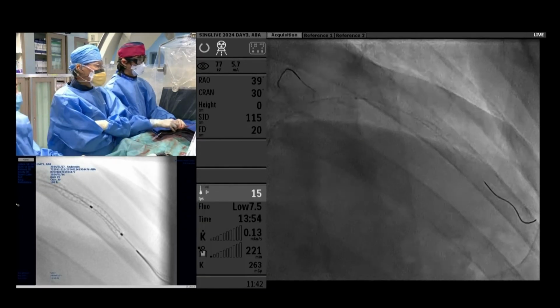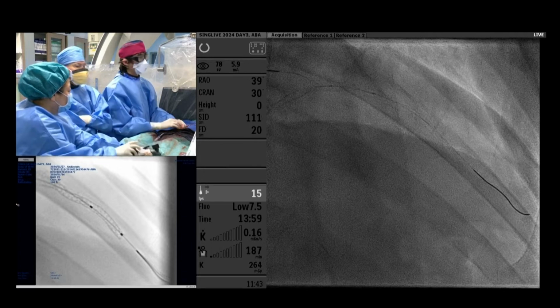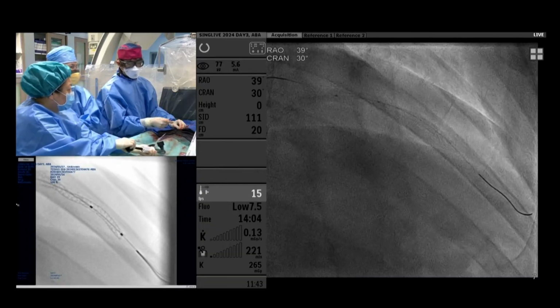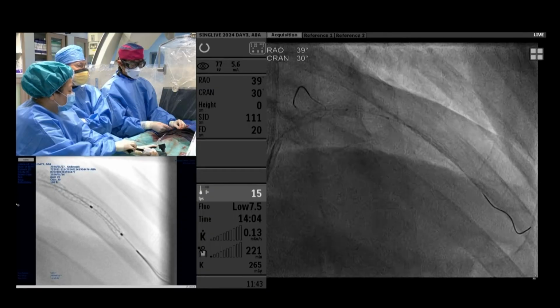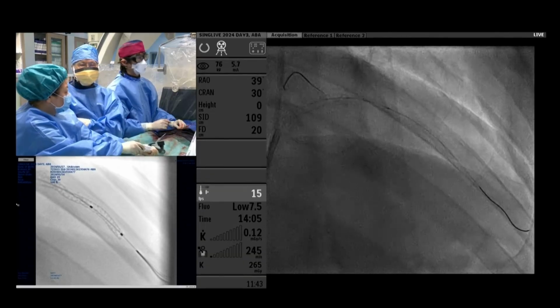Yeah, I think that's a good learning point for those of us who have to do this. Just make sure that the wire you use for your bifurcation and provisional stenting, you are aware of their properties. For me, I learned from Aaron the Fielder wire, so it works for me, and I usually can pull it out. Yeah, the Fielder wire has been well described, easy to remove and doesn't damage anything.